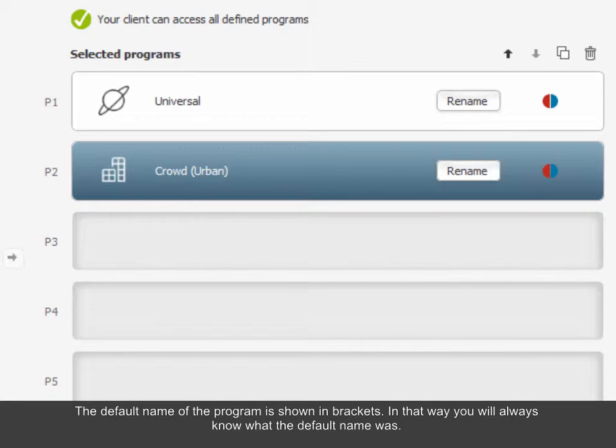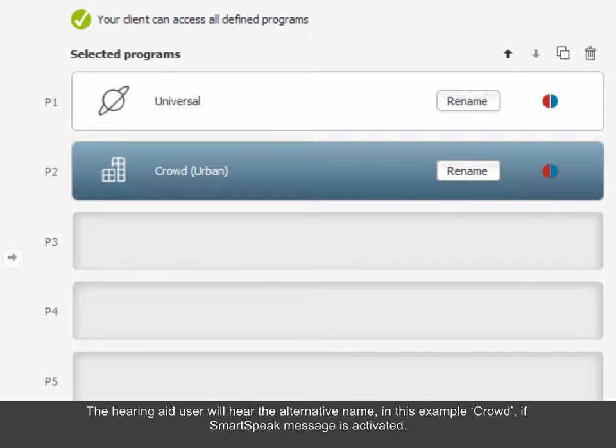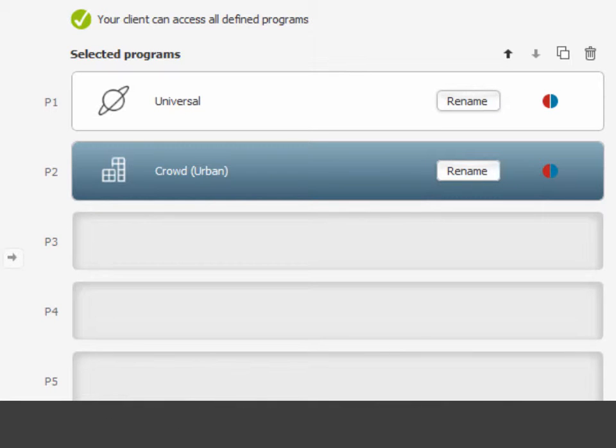In that way, you will always know what the default name was. The hearing aid user will hear the alternative name, in this example Crowd, if SmartSpeak message is activated.